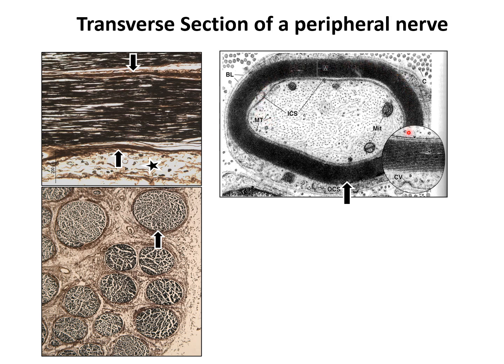This is the electron microscopic picture of a nerve fiber showing the myelin sheath with the alternate dark and light lines. These are the major and minor dense lines in the myelin sheath. Inside is the axoplasm containing the mitochondria, neurofilaments, neurofibrils, and these are the Schwann cell cytoplasm, outside which lies the connective tissue or the endoneurium.